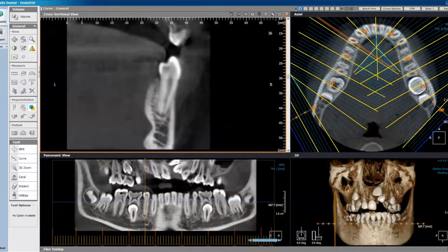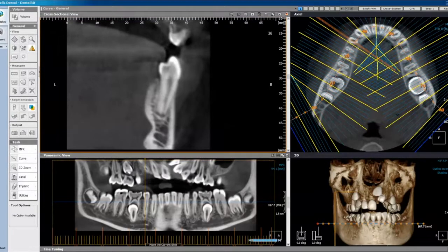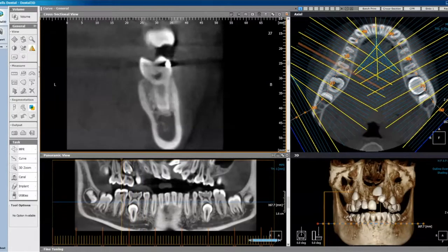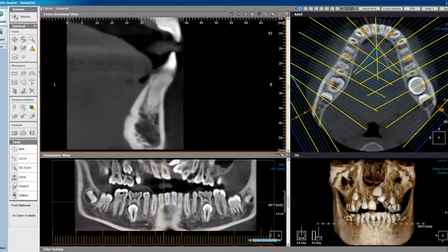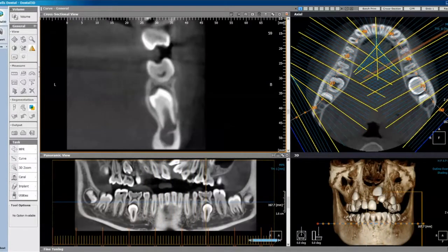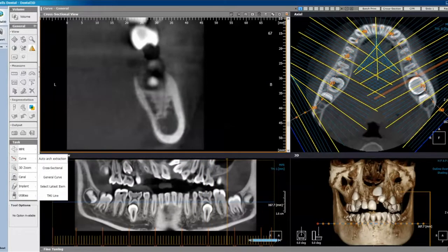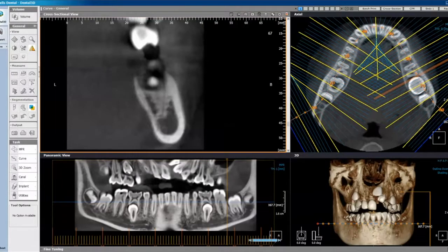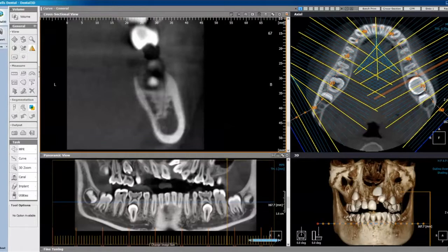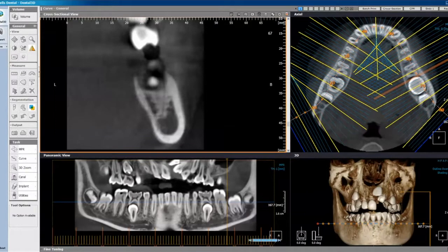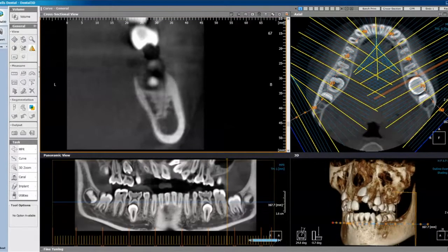We can manipulate that several ways and we'll review that in a separate tutorial. I can move the transaxial slice and look in the upper left window pane and see the anatomy of interest as I travel along this arch that I've created using the auto extract method. This will actually save this project, and if you look at the toolbar at the top, there will be a number one in a blue box which represents this arch that I've created. Any manipulation of this particular project will be saved in this first box.